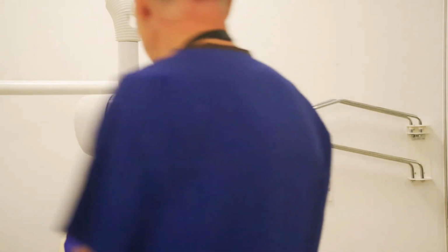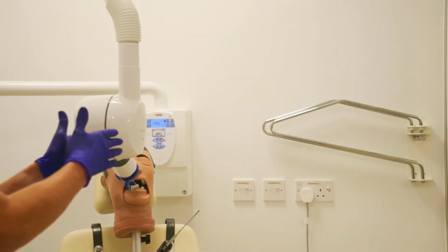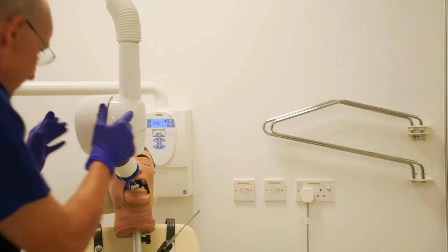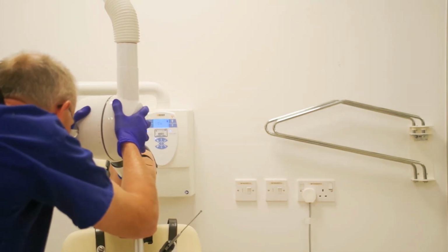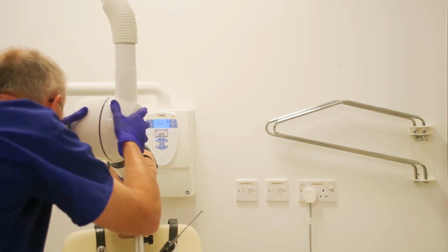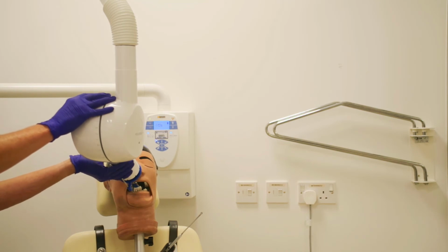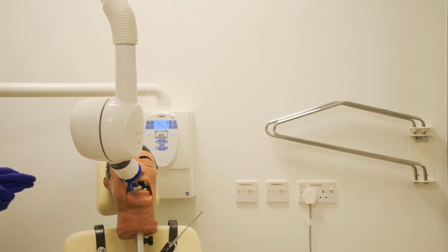Having done it from the side, I now need to come round the back of the tube here. I have to stand in line with it and see whether it's lined up in the horizontal angulation. And it isn't, so I need to move it round this way. Now I can see that's beautifully lined up. And the very last thing I do, again, exactly as Colin showed us, is to just tilt that so that little notch is lined up.